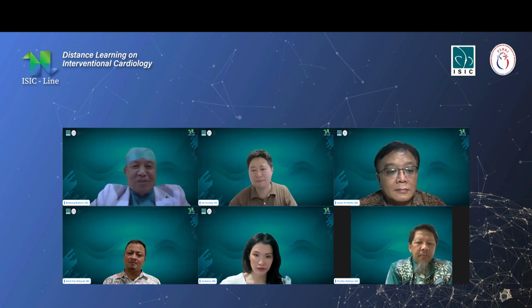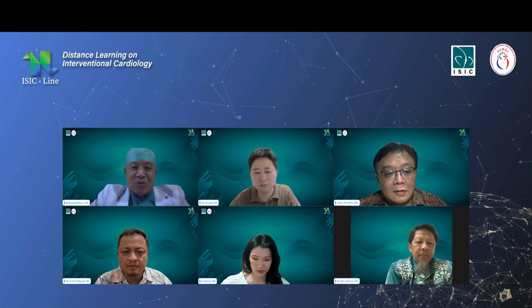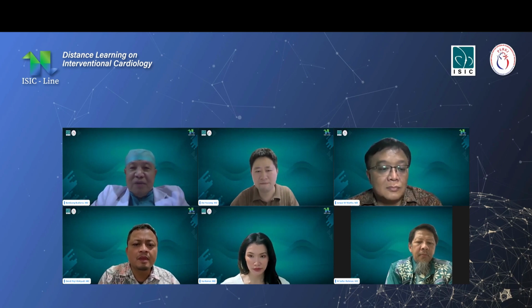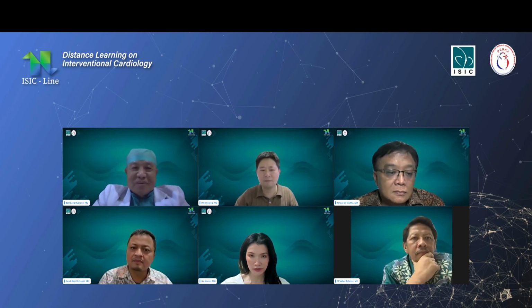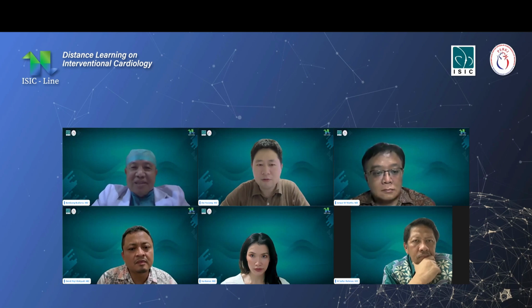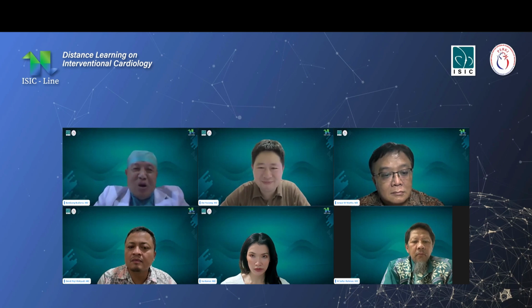Thank you. So before we close this session, I just want to take the opportunity to ask you one question. When we want to deliver BRS, we have to make sure that we only have one chance to go to the target vessel and then deploy. We don't have a second chance, right? So do you recommend using a guide extension to make everything simpler and easier, and guarantee we can reach the target lesion easily?